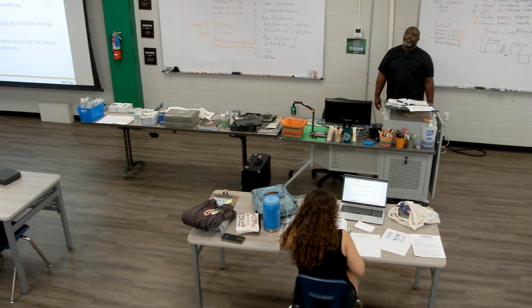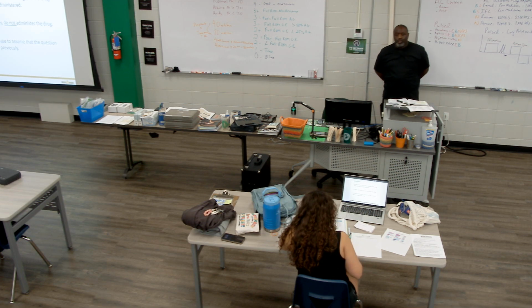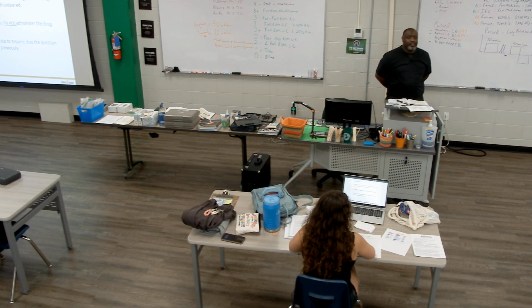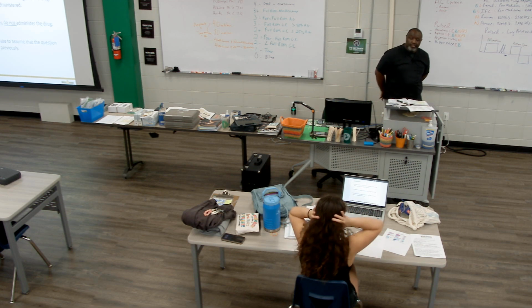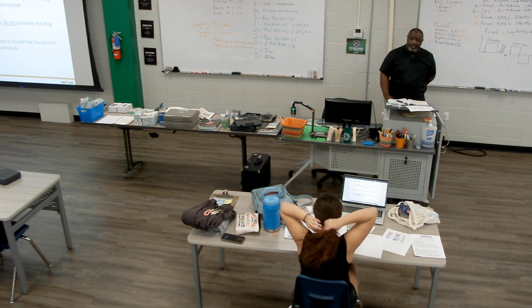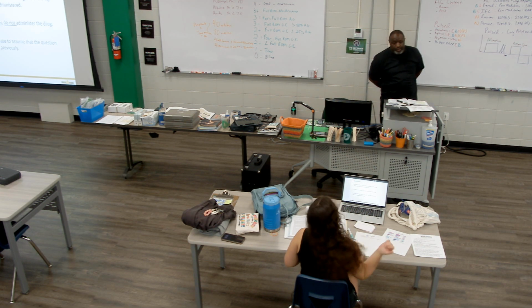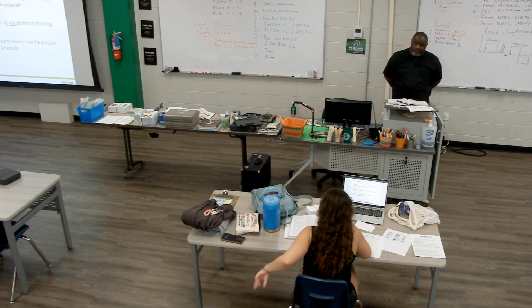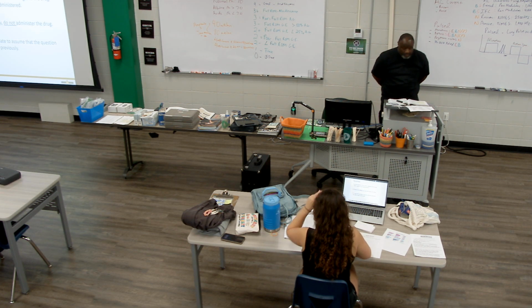There's just not a whole lot. It's got to be really superficial, so it's not something you want to do with a lot of adipose tissue or that's deep. You want it to be really superficial so it can get the job done, because it's not getting that far into the tissue. It's not going down 5-6 inches, it's very superficial, 2-3 inches into the tissue. So it needs to be superficial, whatever you do.